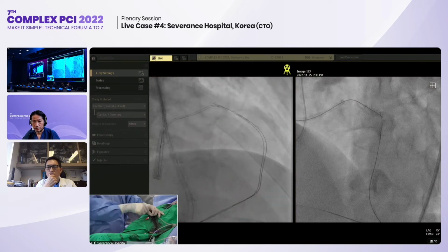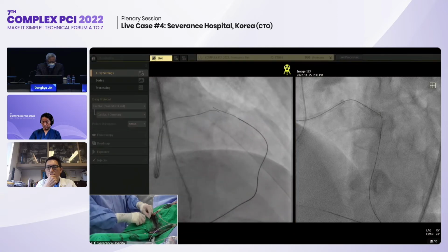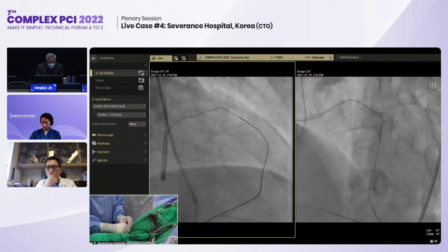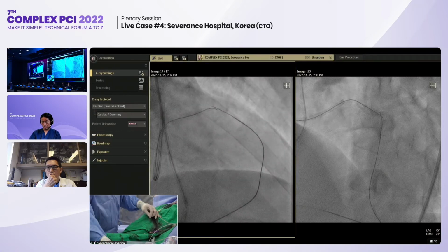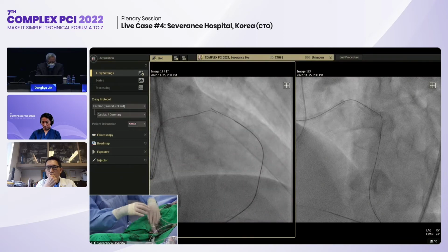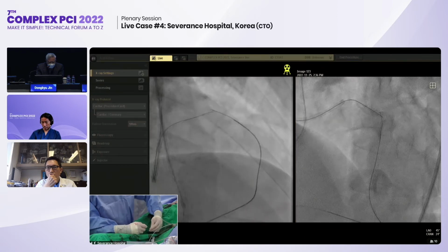the wire marker technique could be more directed, because we know the position of the distal cap? If you use a more directed, controllable wire antegradely, is there any chance we can advance the wire into the true lumen using a wire marker technique? Or do you think that because of calcium, a reverse CART will be more feasible?